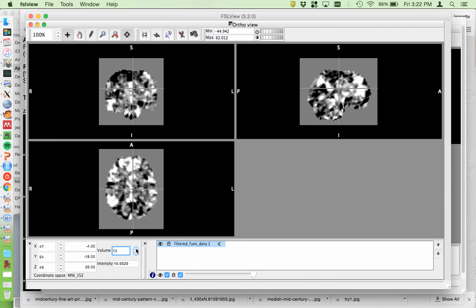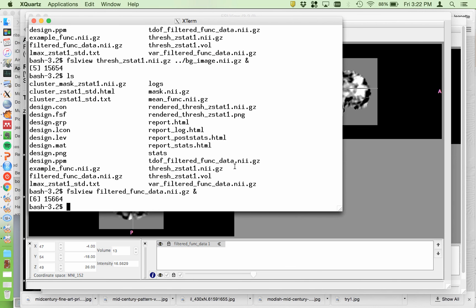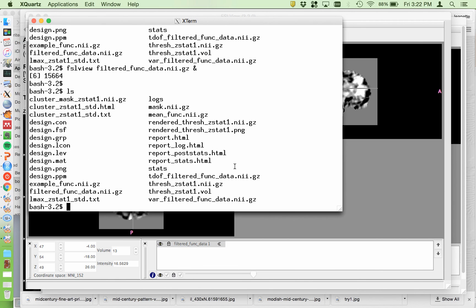I think that's about it. It's kind of up to you at this step if your analysis worked out or not. Let's see what other files are in here.